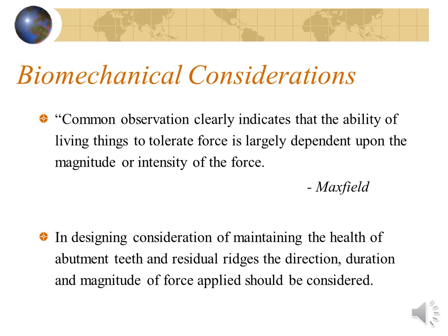The forces occurring with RPD function can be widely distributed and directed, and their effect can be minimized by appropriate design of the RPD. An appropriate design includes the selection and location of components in conjunction with a harmonious occlusion.